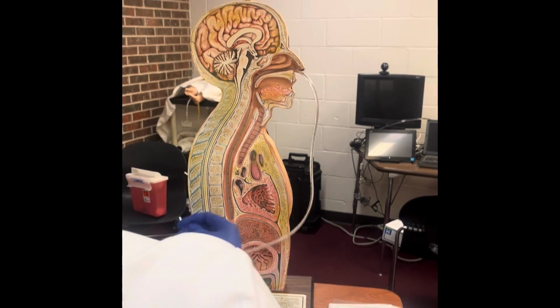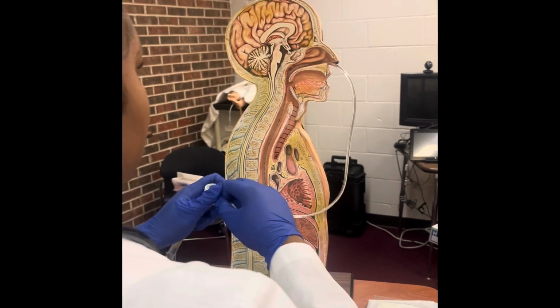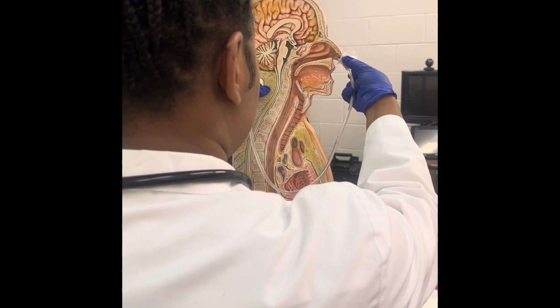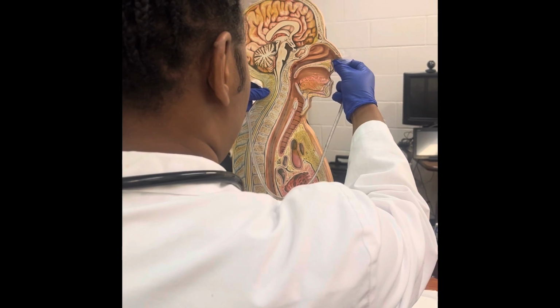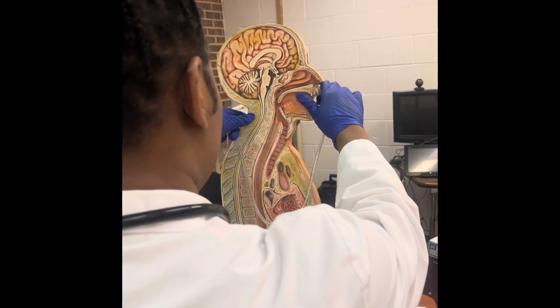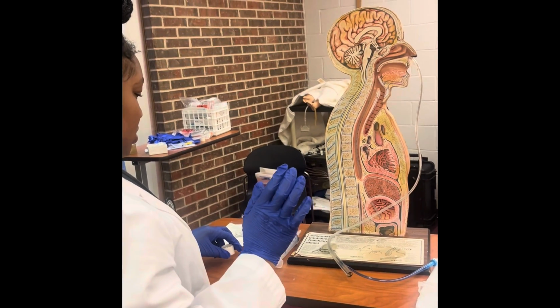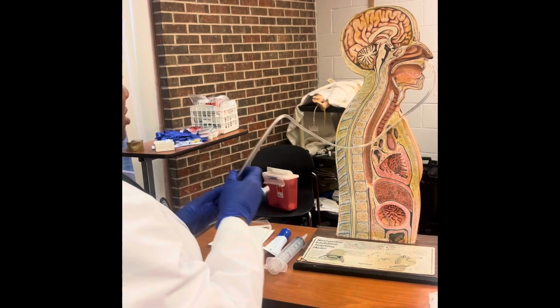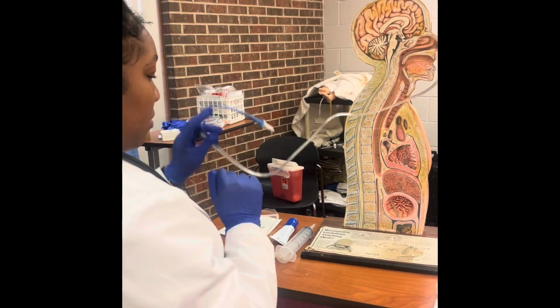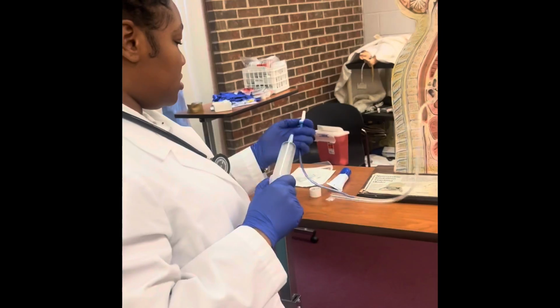Make sure not to pull on the patient, and tape it to their nose so it doesn't come back out. And then I can also use some tape to mark where it is, just in case it slips out or it moves, so the next person will know, or I'll know. And then I can clamp this to the patient's gown or bed, or even hook it up to suction if needed.